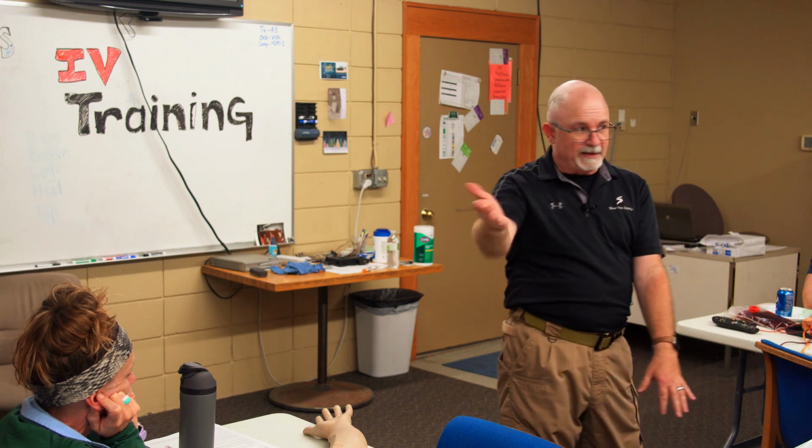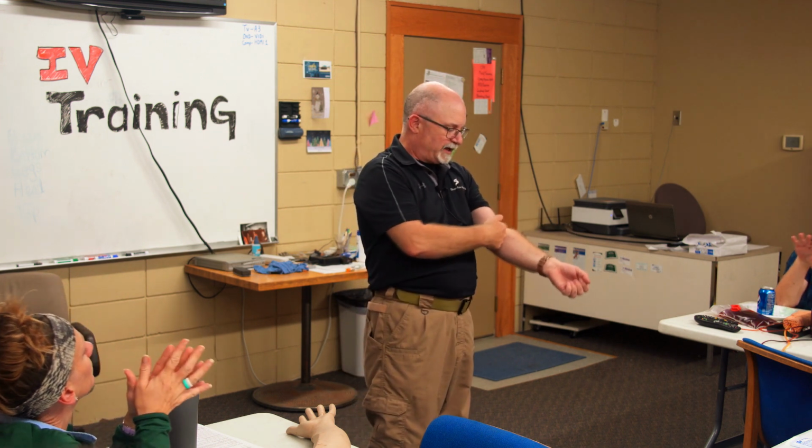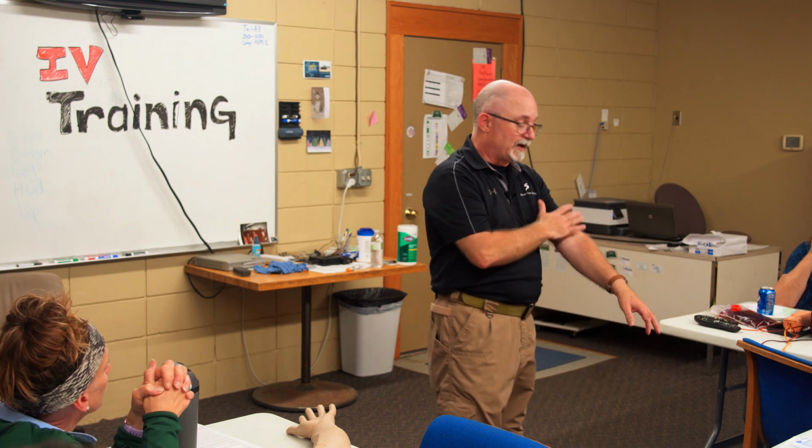All right, so yes, the theory is we generally start low and work your way up. Because the theory being, I poke a big hole up here and I don't get it, so I start back down here, stuff might leak out this hole upstream as it's going back up. There again, yes, that's the principle. However, if I get this one and I don't get it and I need this line, sometimes I'll see if I can go someplace else. But in principle, start low, work your way up.